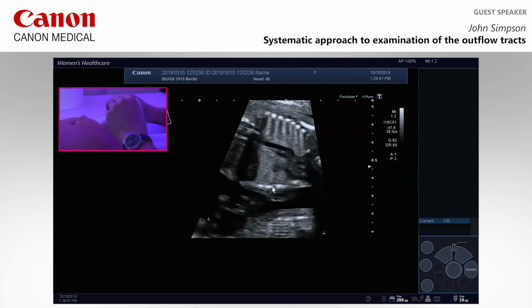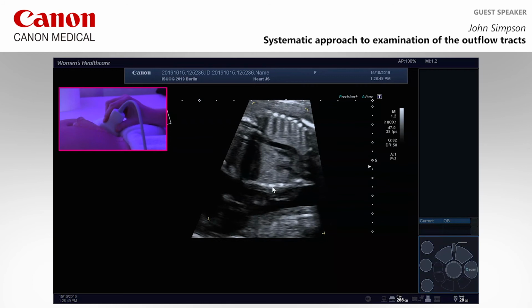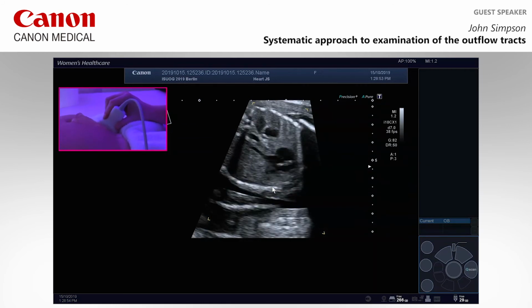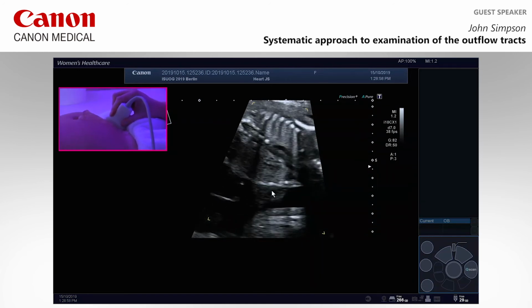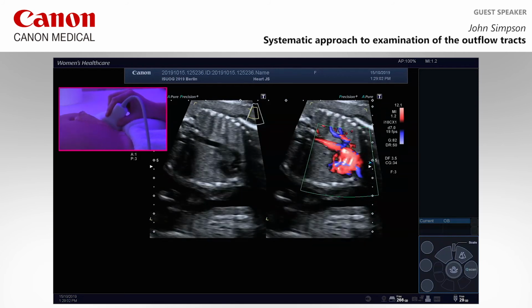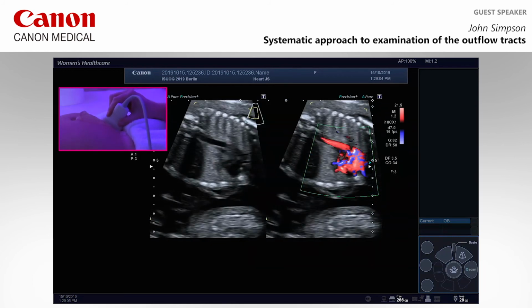See if I can bring in the arch, not completely spine up, but now switching more into the true arch views. IVC, nicely seen coming through here. And higher scale for the arches.